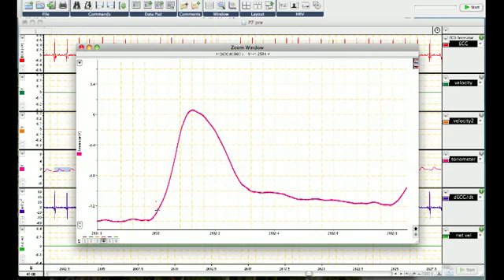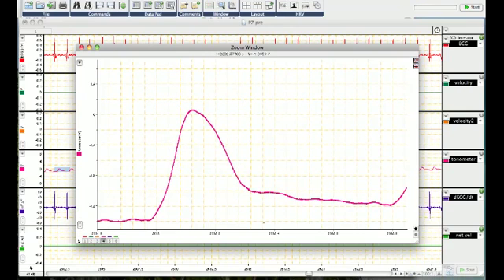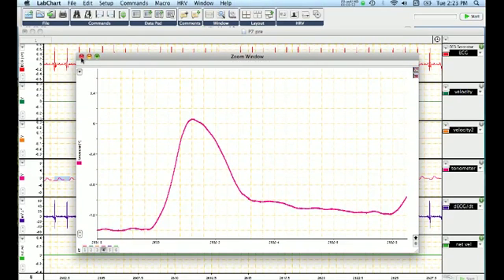This is one particular waveform with a trough around negative 1.3 or 4 and a peak just above 0. And the mean for the whole thing will be the average area under this particular curve: the area under the curve divided by the time. That'll be your mean pressure for that particular waveform.